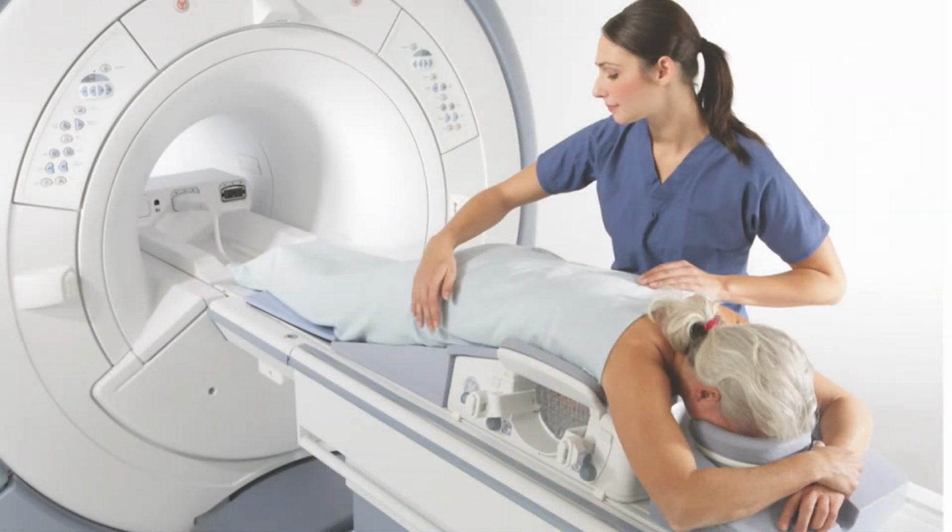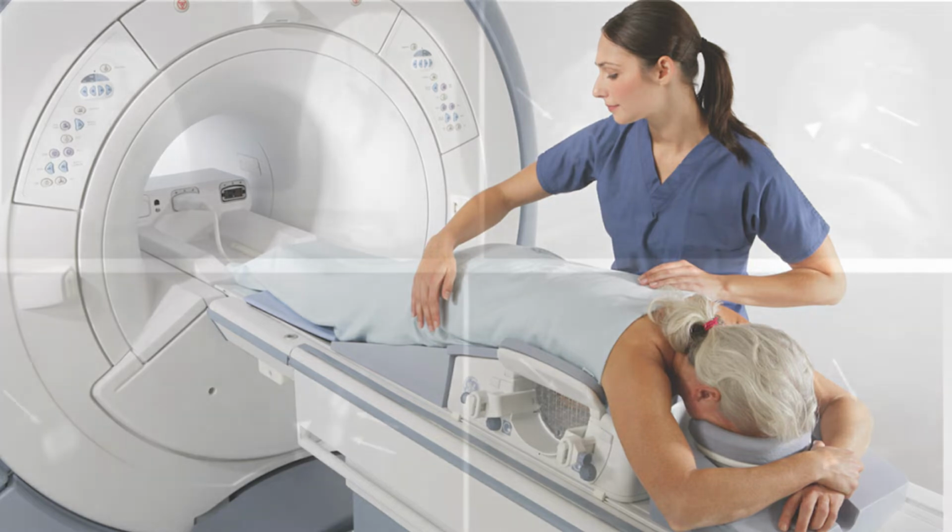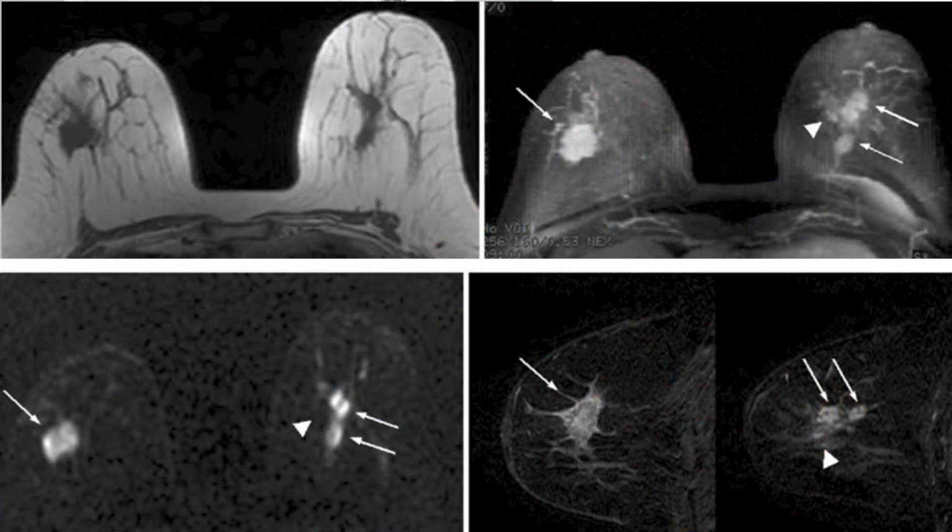As far as supplementary imaging options, MR has been considered the gold standard for finding the most cancers in women with dense breasts. But there's a problem. It's not approved as an actual adjunct to screening at this point, and it requires an intravenous injection. There's problems with claustrophobia and access to the equipment. You need MR equipment, which is very expensive, and to continue to improve, you have to have higher strength magnets, which gets even more expensive. So there's quite a limitation.